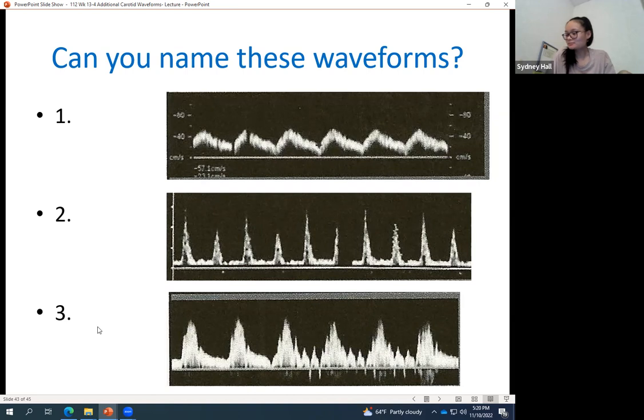So they're actually doing a temporal tap. Okay, so it's an ECA. They Doppler, they put the probe, and they're like, I'm 90% sure this is the patient's ECA. It looks like ICA, but they temporal tapped. I've got a temporal tap going on, so that is ECA. I proved it with my temporal tap, but it's very low resistance. So this is internalization of the ECA. This ECA has become internalized. It's very low resistance.